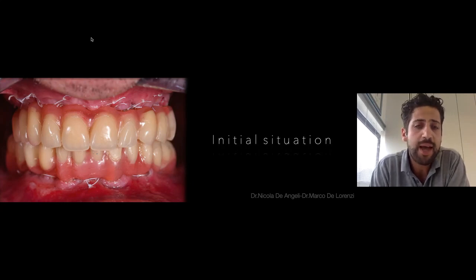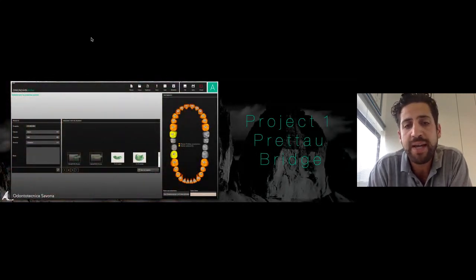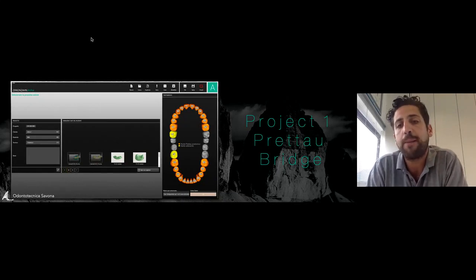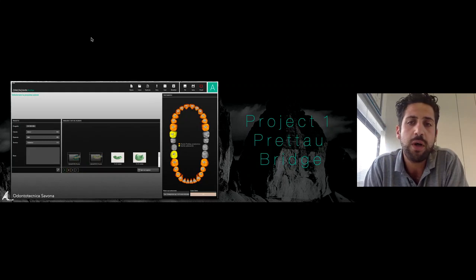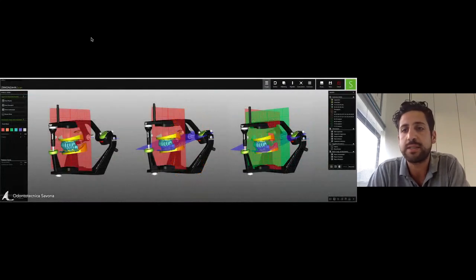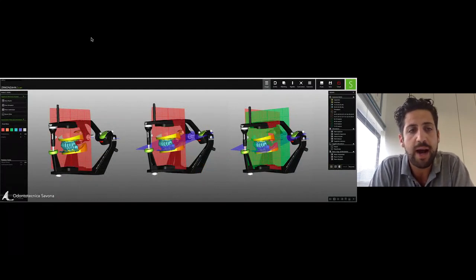So in the lab, we received the 2 impressions with the transfer. We made the models, and we started to make the project. Project 1 was a Prettau Bridge. That means in our software, we have the possibility to mount teeth and gingiva in the same project. So this is the result after the scan. We place our models in the individual articulator. We also received two intraoral scans that you can see in blue as a reference.